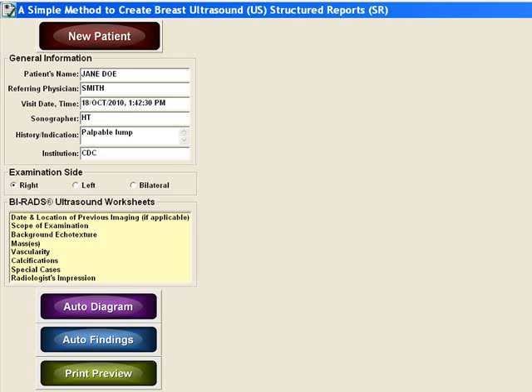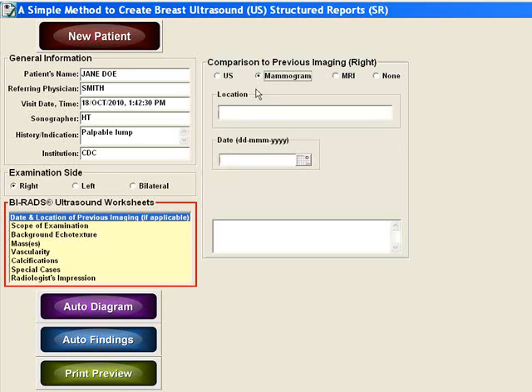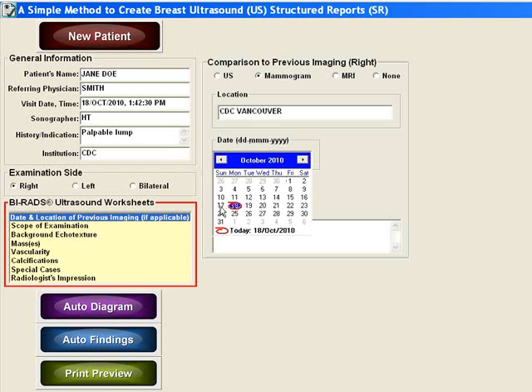Select the examination side. In this next step you will record any prior imaging the patient has had. Suppose the patient has had a mammogram — select mammogram, then enter the location of the prior study. After that, select the date of the prior study.